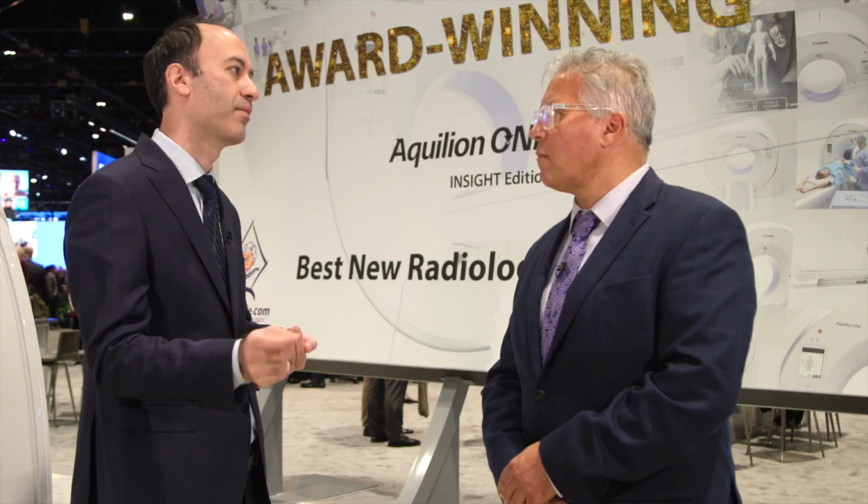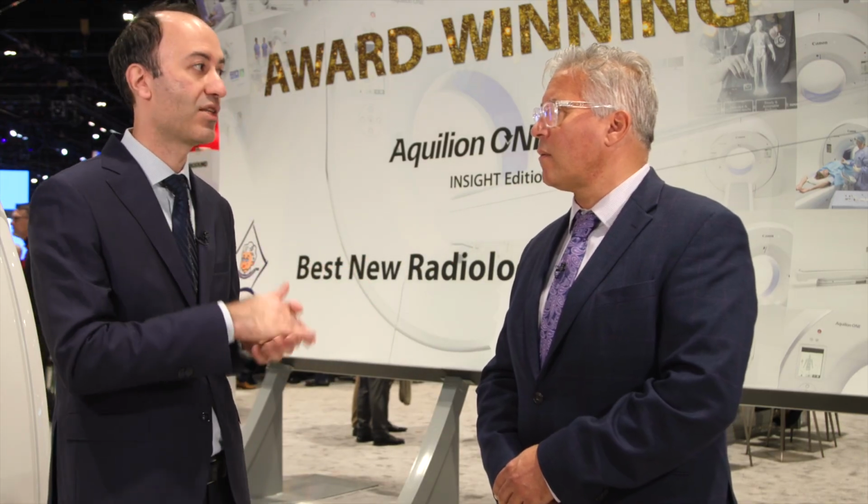So there are studies that already show that high resolution images may downgrade the pre-existing CAD-RADS category which was assigned to one specific lesion. So that's a huge thing for the future, and for overall better interpretation of the CTA coronary artery images. That changes the management. The patient who was sent, for example, to the cath lab for further evaluation, with this method may not need it, at least for some time. So that's really a huge thing for the patients and for us as physicians, to keep the resources for patients who really need it. Right, no, that makes an awful lot of sense.